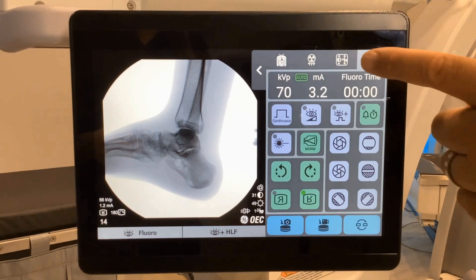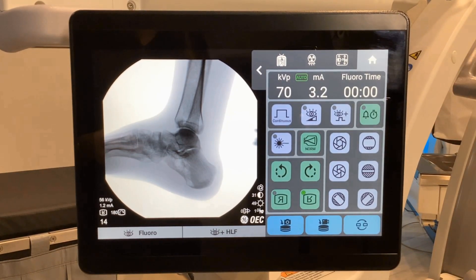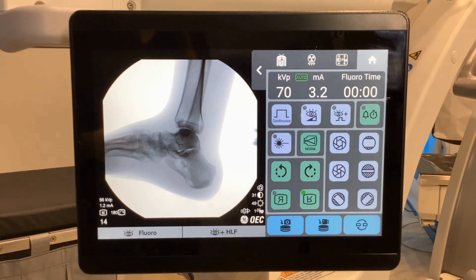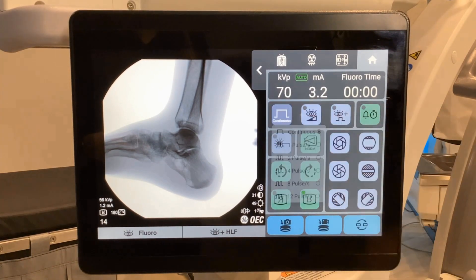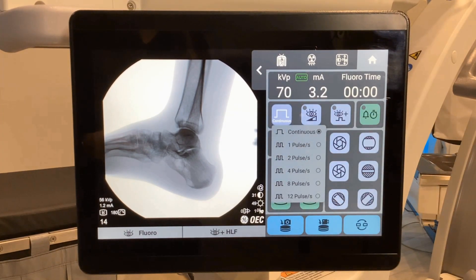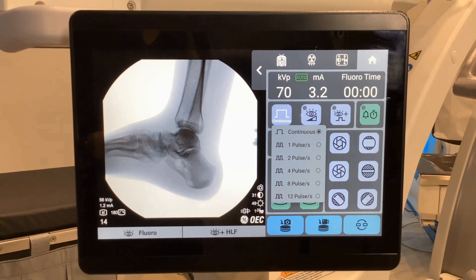Home screen. The default rate is continuous imaging. Press continuous to enable pulse imaging when desired. Pulse rates depend on software configuration.